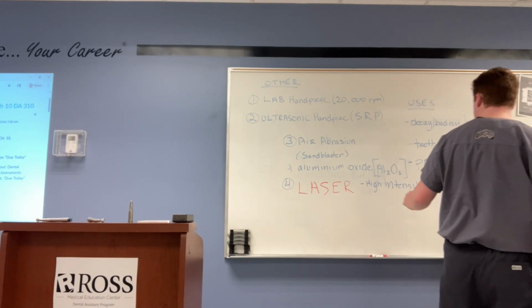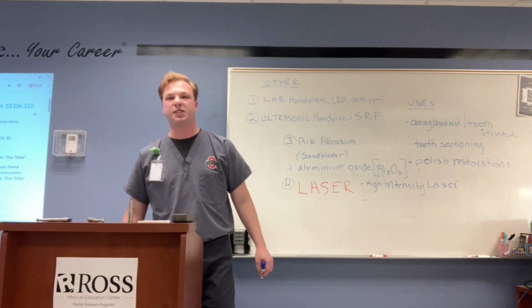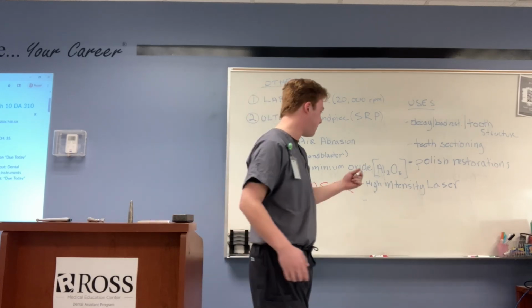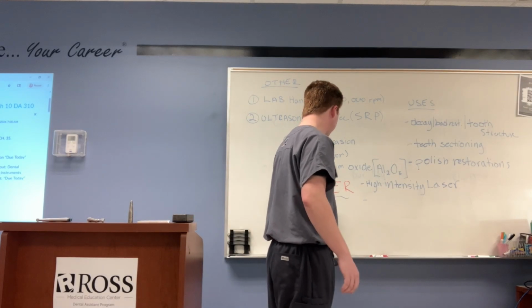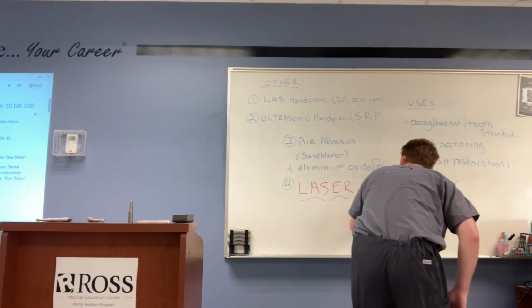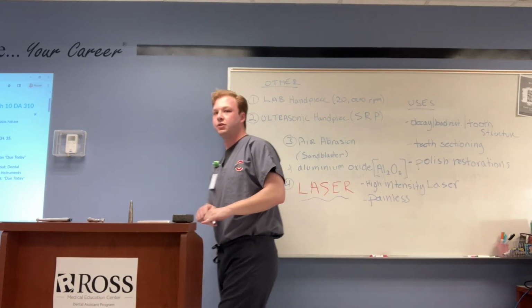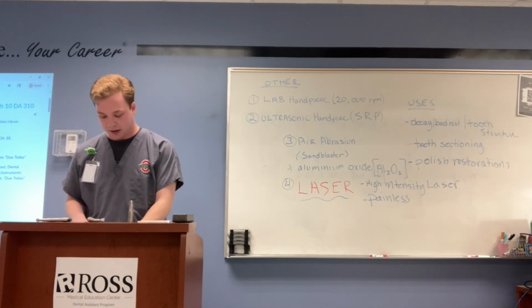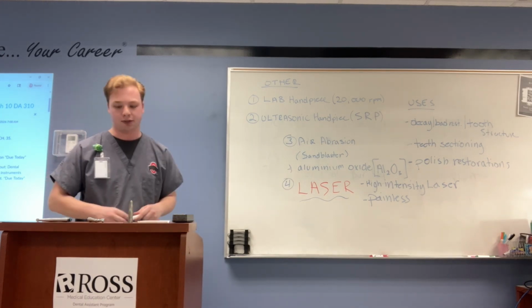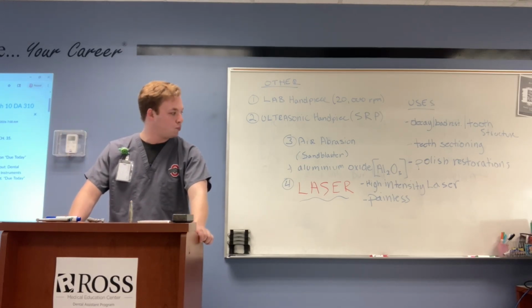But it uses a high intensity laser. And the benefit of it is it's painless and you don't have to wait for anesthesia to work. So the benefit of this laser, spelled with an S, is it's painless, and patients like it because you don't have to wait for the anesthesia to work. But they also use it for crown lengthening too, the laser.